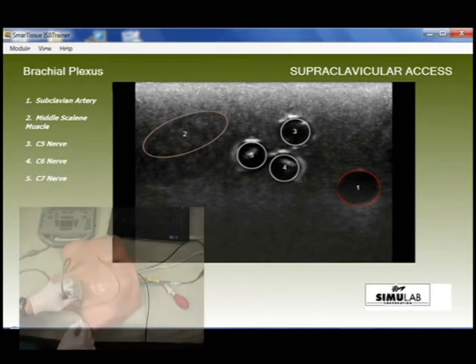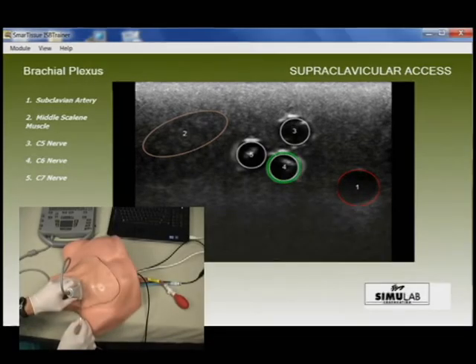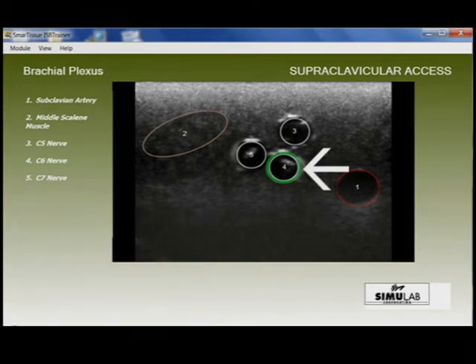This communication between the tissue and a PC indicates to the user when the needle is proximal or in contact with one of the nerves, showing green when proximal and red if penetrating the sheath.